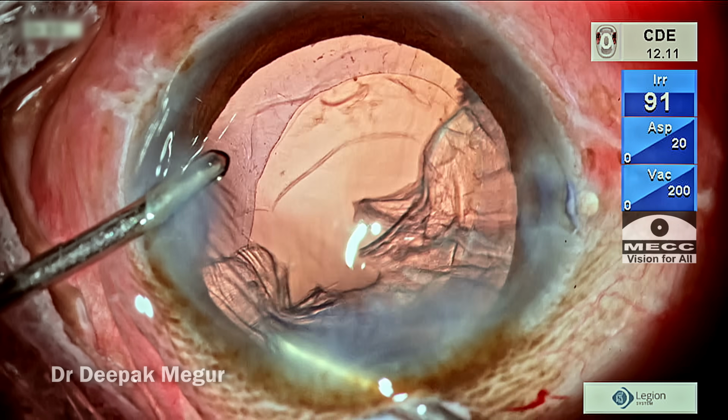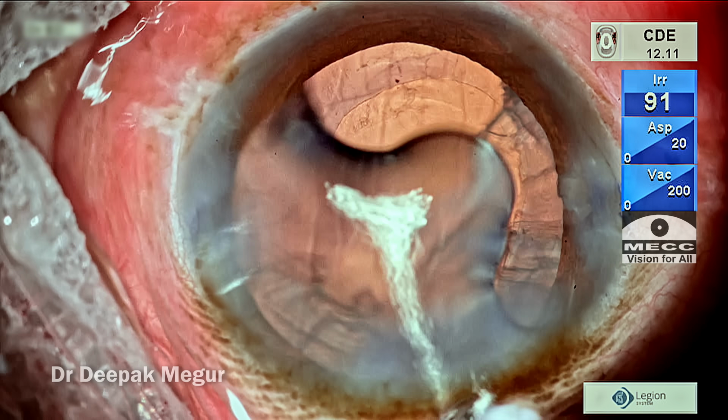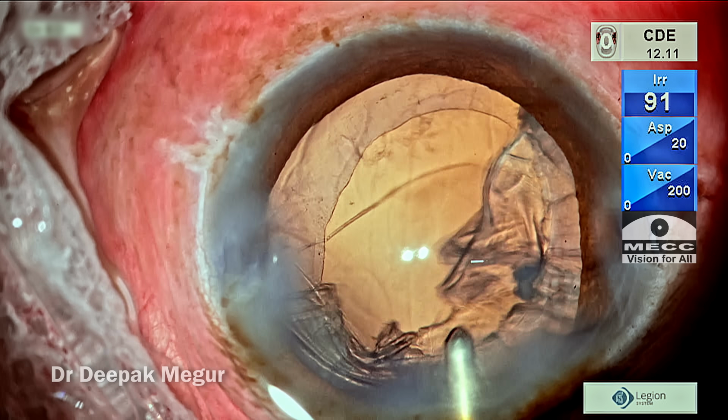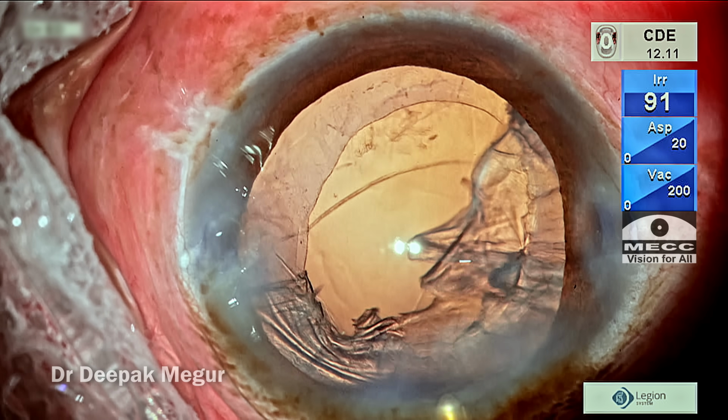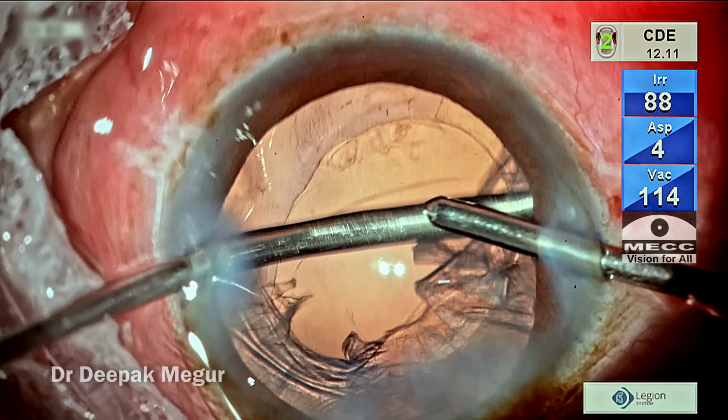The fragment which I thought had gone out is still hiding inside, and this is not coming out. I just don't want this small fragment to drop down. So before I do vitrectomy, I just want to burp this out, and then I'm going to switch hands and try to remove the cortex from the other side.